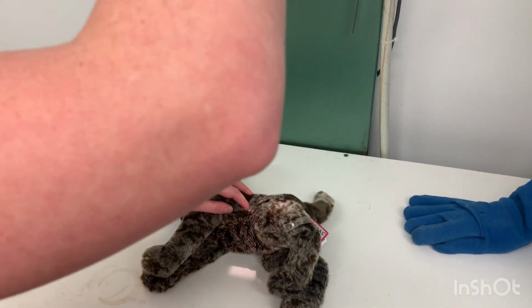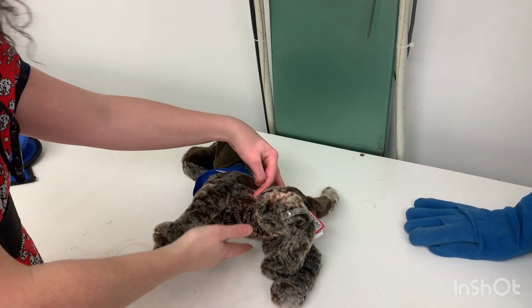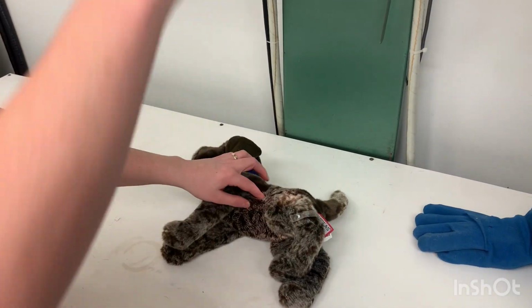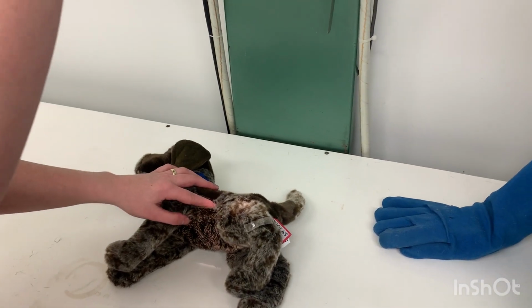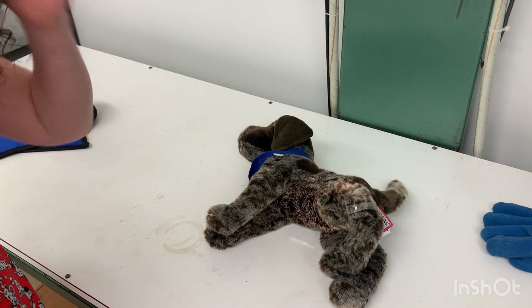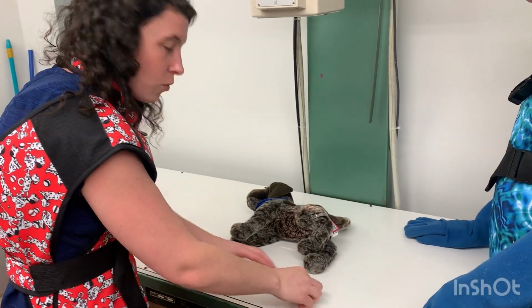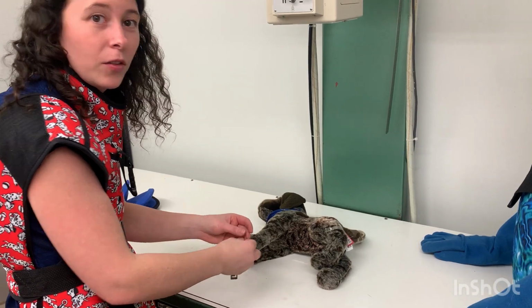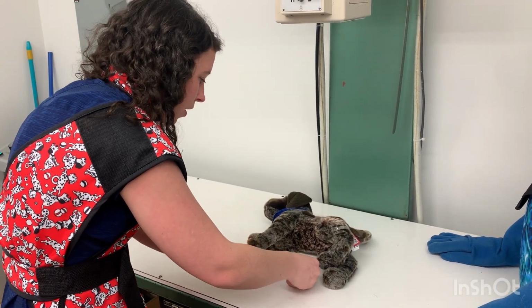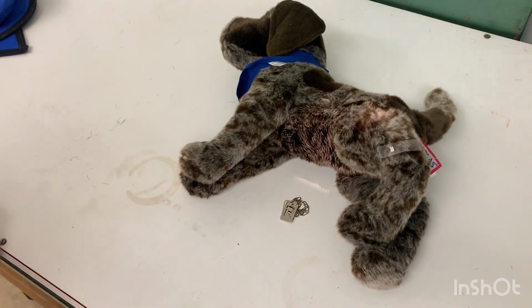And then we can take it down a little bit this way, because we don't need to have everything exposed out this way, and taking it down will decrease the scatter that we have. So that's important to do there as well. So that's about what we need. So we're about good there. And then for right lateral, we're going to put the marker on here. So this is the right.